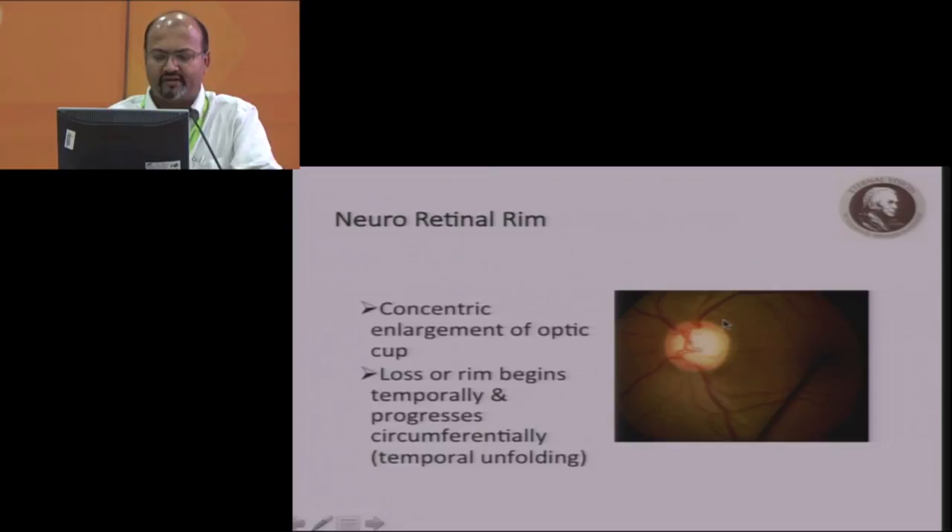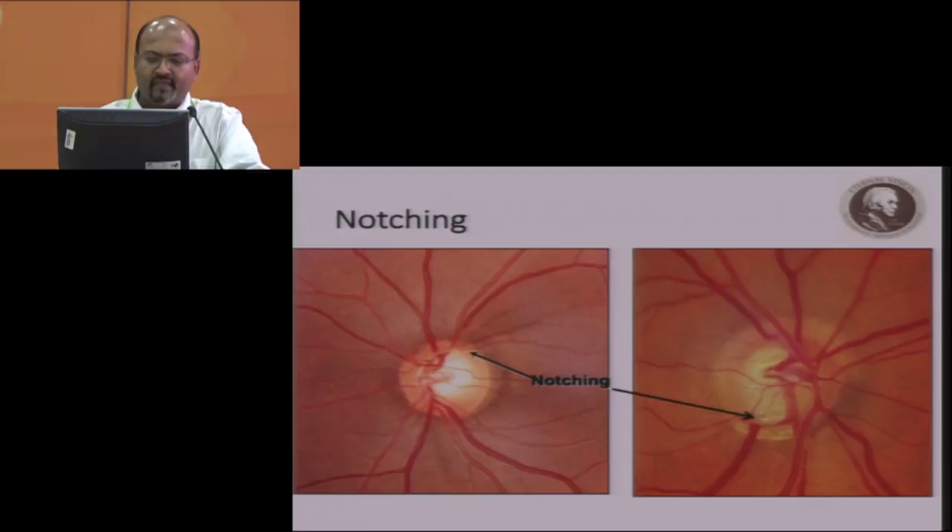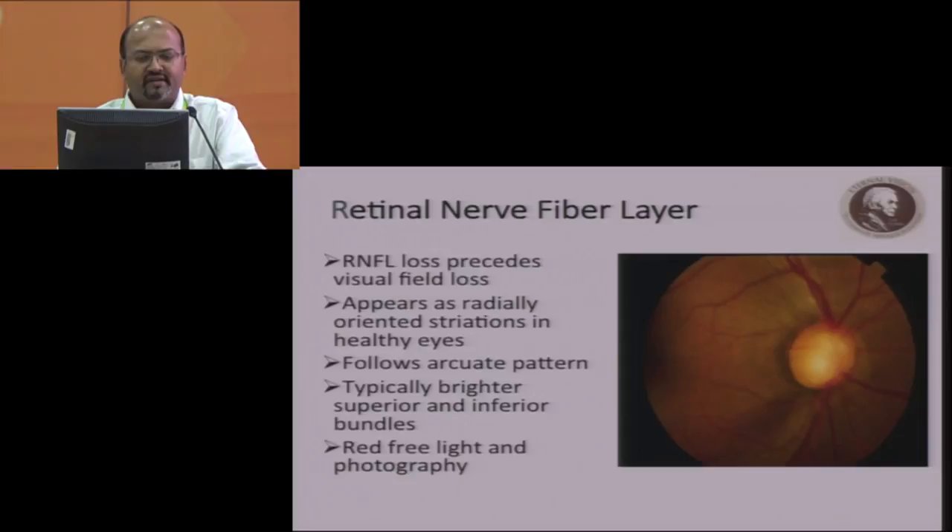Other features include concentric enlargement of the optic cup. The rim loss begins temporally and progresses circumferentially — this is known as temporal unfolding. Notching is a focal defect of the neural retinium in certain areas. In the neural retinal rim, features suggesting glaucoma include focal atrophy, selective loss of neural retinal rim in the inferior and superior temporal sectors, vertical or oblique cup enlargement, and violation of the ISNT rule.